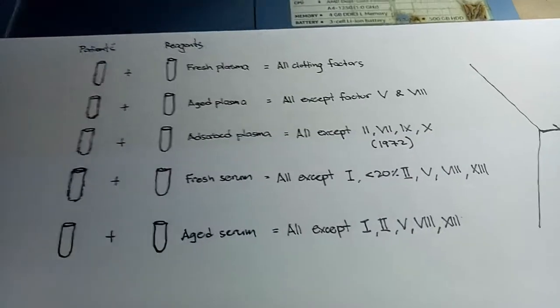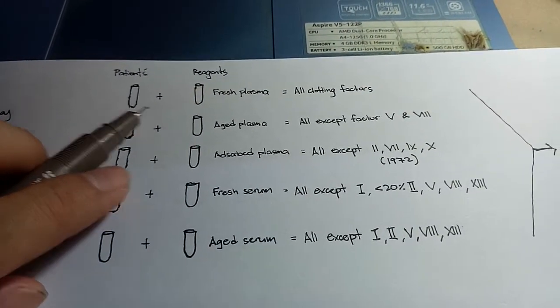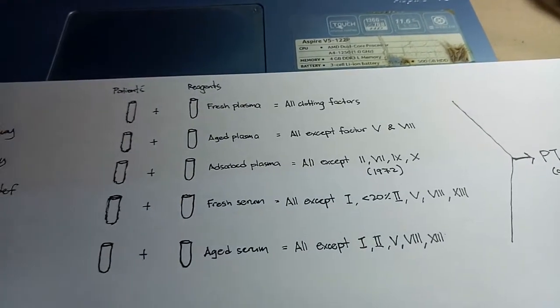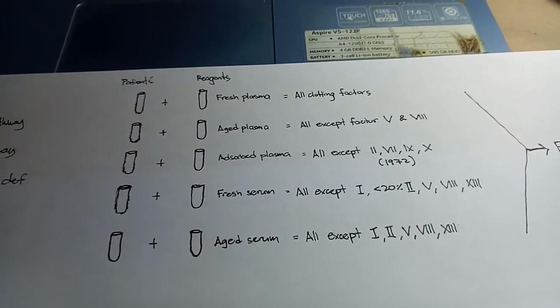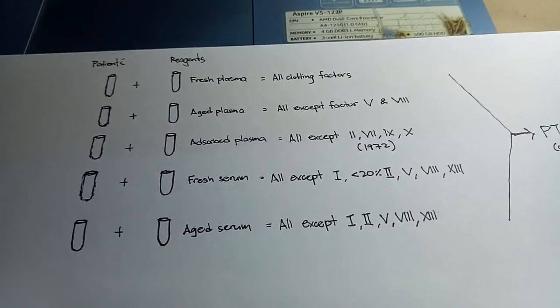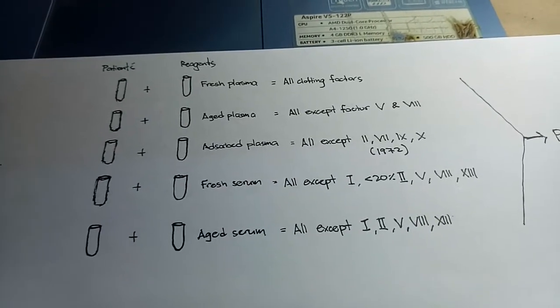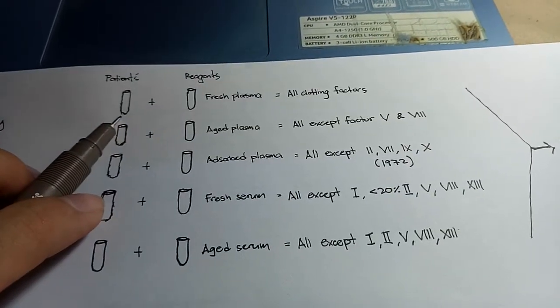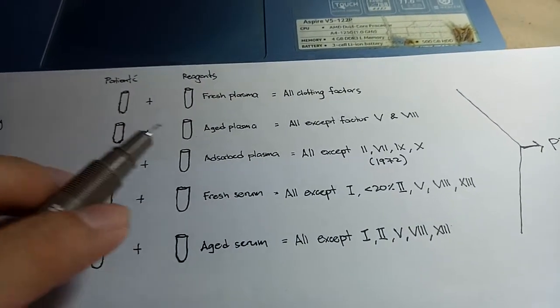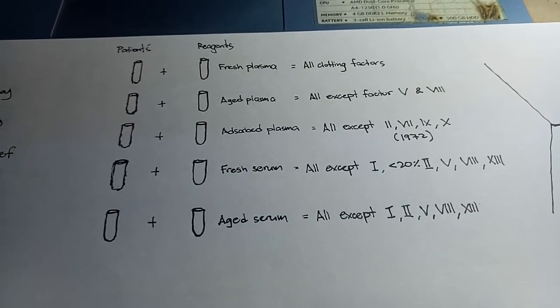So, ngayon, one part of patient's plasma will be mixed with fresh plasma. Mix talaga guys, as in ipaghahalo talaga siya. Kaya nga tawag sa method na to is mixing studies kasi imi-mix, okay? So, ito, patient's plasma will be mixed with fresh plasma and so on. Patient's plasma will be mixed with aged plasma, ayun, okay? So, gets niyo na yun.